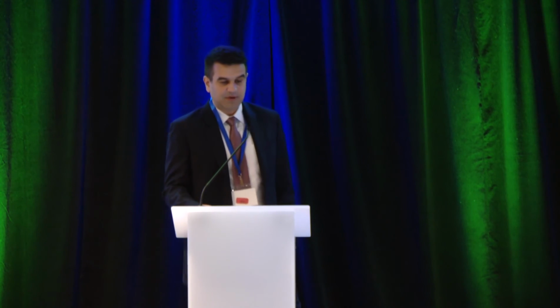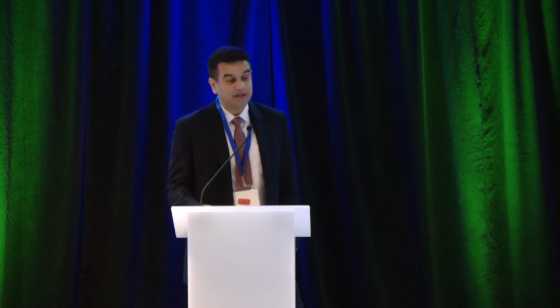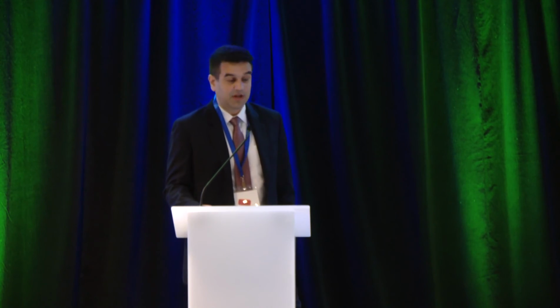An inconclusive diagnosis of IEM means that you have 50 to 70% ineffective, but you don't meet the criteria of at least 50% failed. And you see the paired clinical algorithm here, which really talks about how to think about the inconclusive diagnoses and what really will strengthen you or not to think that this is a relevant ineffective motility. And then lastly, if you end up down here where you have no evidence of a disorder of peristalsis, if you do have a high probability, you think clinically, of missing an EGJ outflow obstruction, perhaps you do a solid test meal. You're going to hear about that.